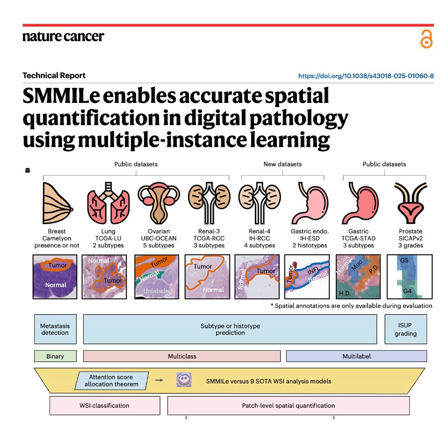I love that analogy. Yeah. The AI looks at the 8 patches surrounding that first patch and asks, do we all agree? Exactly. If the AI is on the fence about a patch, but the pairwise energy reveals that all 8 surrounding neighbors are definitely cancer, the MRF constraint applies spatial smoothness. Peer pressure dictates that this middle patch is highly likely to be cancer too.